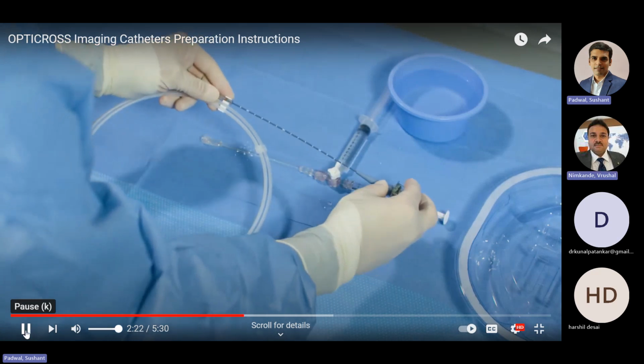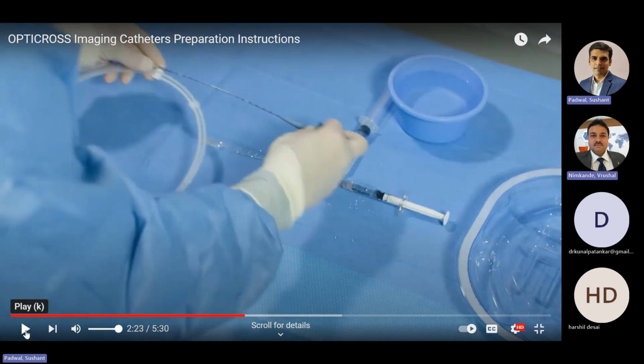Without the pullback sled also you can acquire the image. The reason to inform you is that sometimes at some places the pullback sled is not available, so they feel handicapped that we cannot do the IVUS. It is not like that. You can still perform the IVUS. You can still assess the length, and you can assess the diameters on the cross-section image. The length can be assessed from the dotted dots which are there on the telescope.